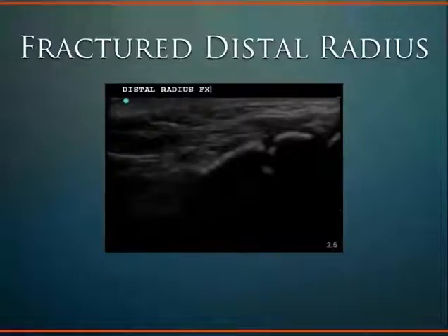surface of the skin, and there typically tends to be a lot of fluid collection and hematomas in association with fractures. And as we know, water and fluid helps the penetration of the sound waves, and so the hematoma actually helps visualization of the actual fracture, so you don't have to push that hard. And so you find that maximal point of tenderness and then visualize there.